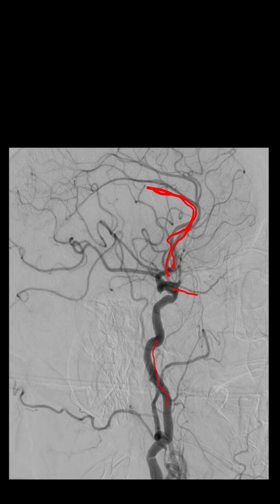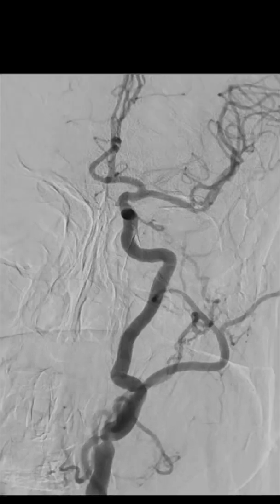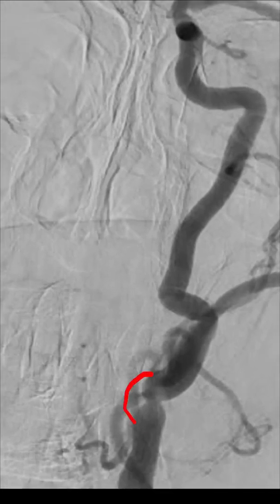So, as we have seen from the AP view, both the anterior cerebrals are supplied from the same side. Now let us have a look at the proximal carotid. So this is the proximal carotid artery, origin of the internal carotid. How much is the stenosis from this picture? Almost 60 to 70%. Yeah, it is not very tight, no.